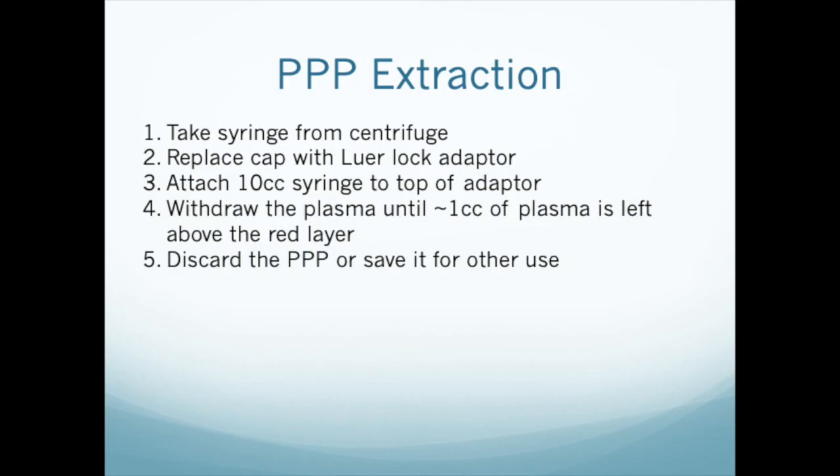After centrifugation, the sample will have separated into two visible layers: plasma and red blood cells. Most of the plasma layer is platelet-poor plasma, so we need to remove that before we can get to the platelet-rich plasma. Take the PRP syringe gently from the centrifuge and, keeping it upright with the cap upwards, remove the syringe cap and attach the Luer-lock adapter.